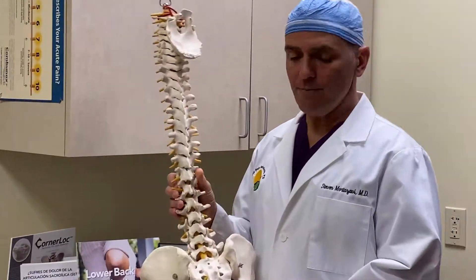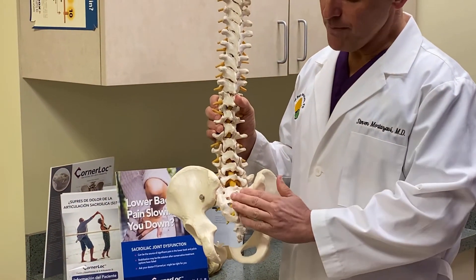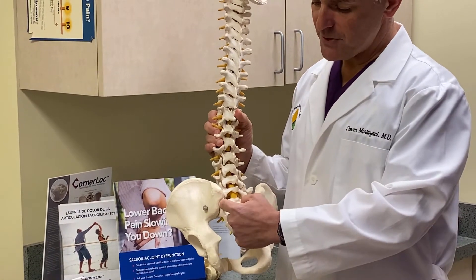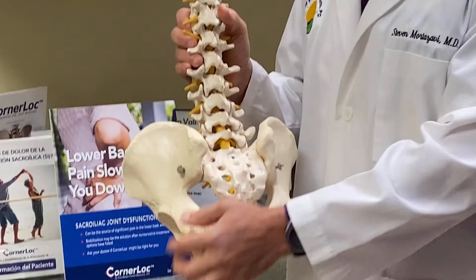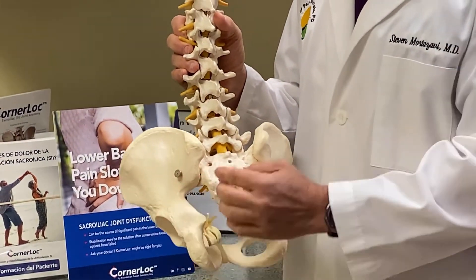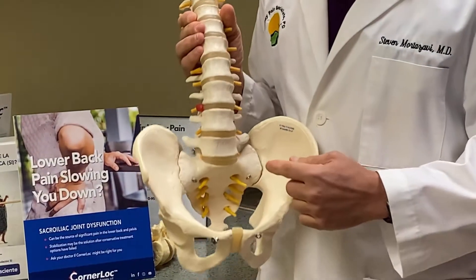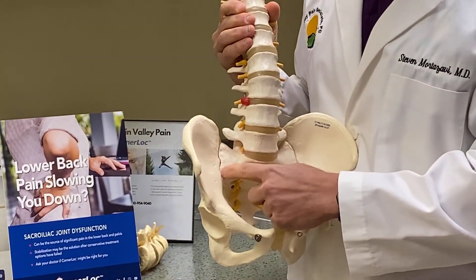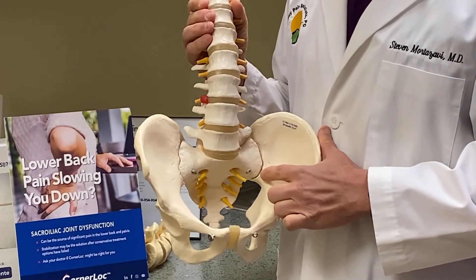If we look at a model of the spine — this is the sacrum and this is the ileum. This area here is the sacroiliac joint. I can better show it to you anteriorly, right over here — this is the SI joint or sacroiliac joint.